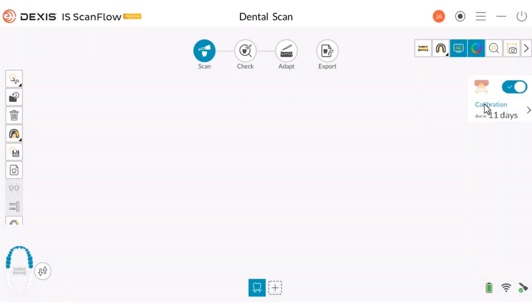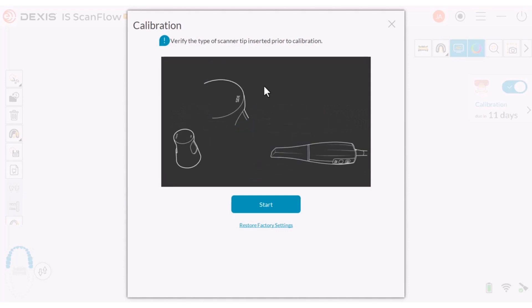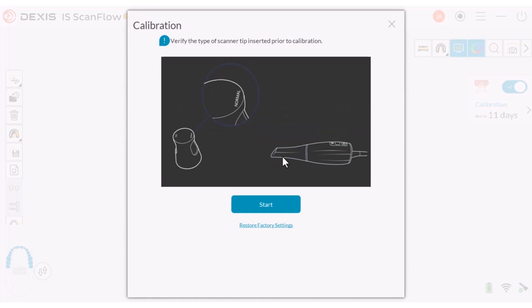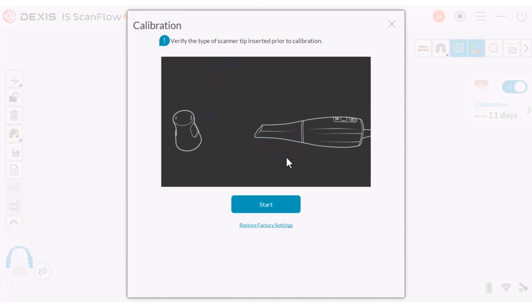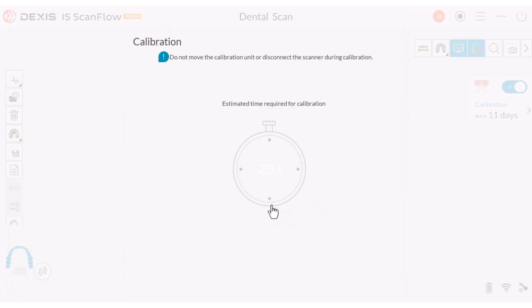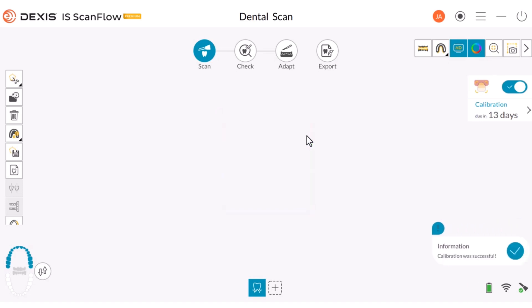Calibrating the scanner for shade matching: after 50 hours of scanning, or approximately 13 days, you should recalibrate the scanner to ensure that the shades are identified as accurately as possible. On the IS ScanFlow acquisition window, click Calibration in the top right-hand corner. The calibration window is displayed. Remove the cap from the calibration unit and install a clean and sterilized tip onto the scanner. Insert the tip of the scanner into the calibration unit, being sure to use the correct opening. Click Start and the calibration begins — a countdown clock is displayed. When the calibration is finished, a message is displayed confirming the color calibration success.